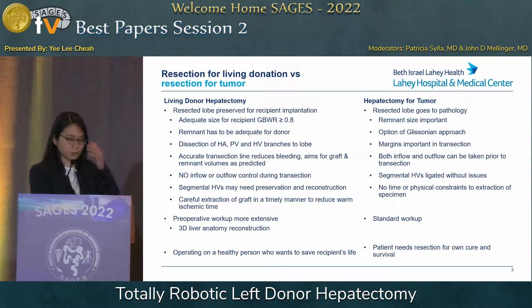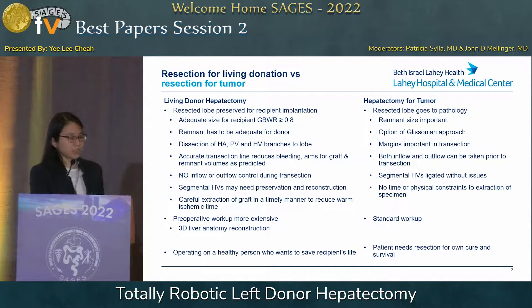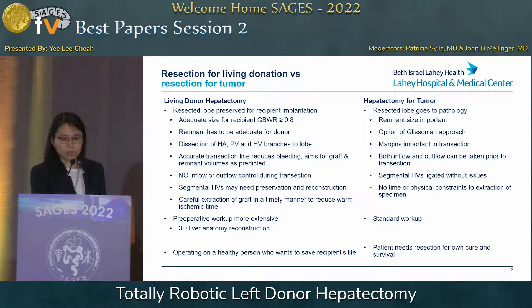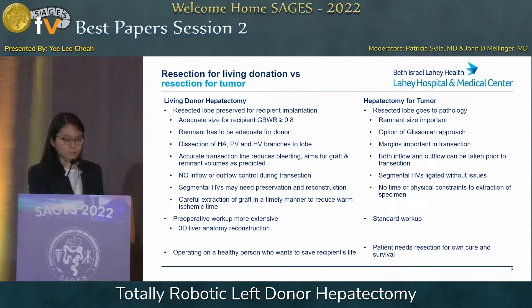I would like to go through some of the differences between a resection for living donation versus resection for tumor. For a living donor hepatectomy, the resected lobe has to be preserved for recipient implantation, so it has to be of adequate size for the recipient. We calculate the ratio of the graft to the recipient body weight, which should be about 0.8%. The remnant has to be adequate for the donor — we aim for at least 30%. We have to dissect the hepatic artery, portal vein, and hepatic vein branches to the lobe, as these will be used for reconstruction and anastomosis in the recipient. An accurate transection line is important because it reduces bleeding and allows us to reach the aimed graft and remnant volumes as predicted.